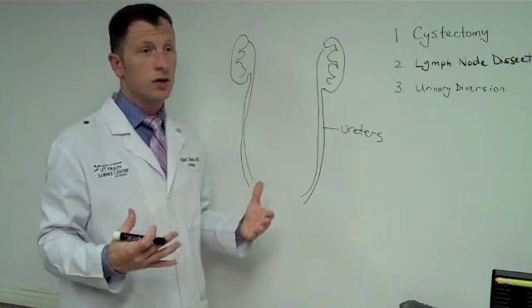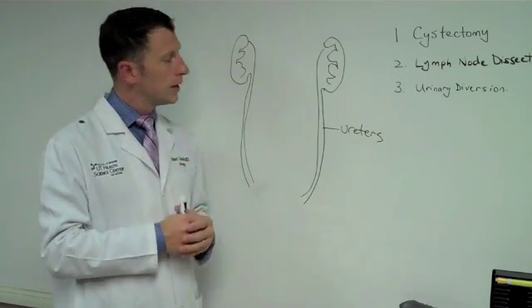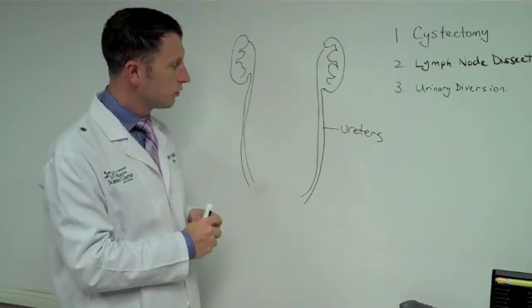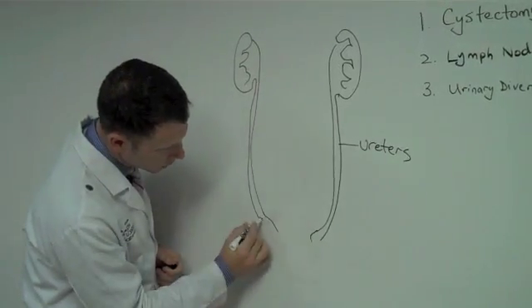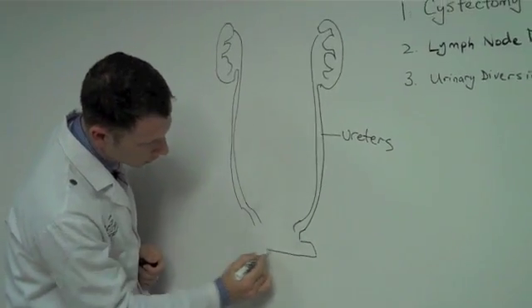We have plenty of intestine. So we take a small segment and use that as a means to bridge a gap. In this patient, what we'll do is what's called an ilial conduit.